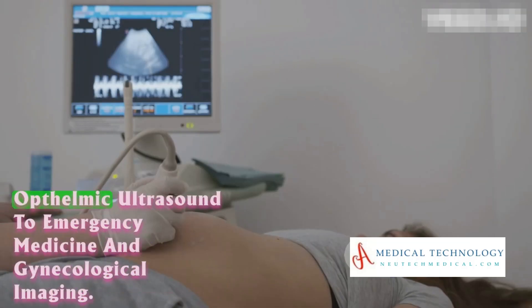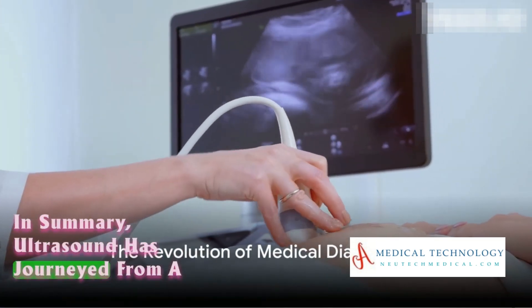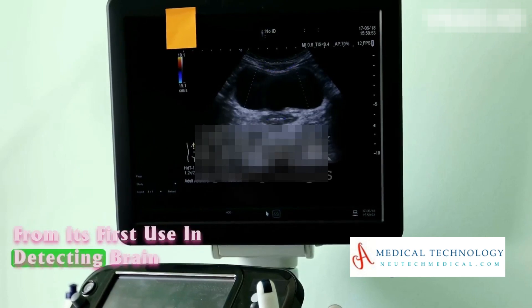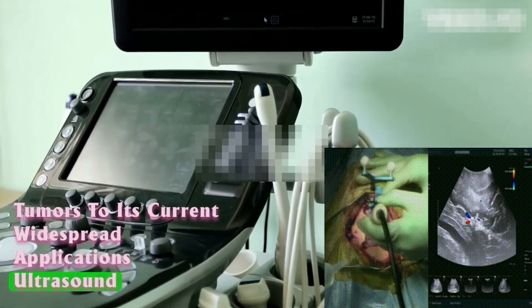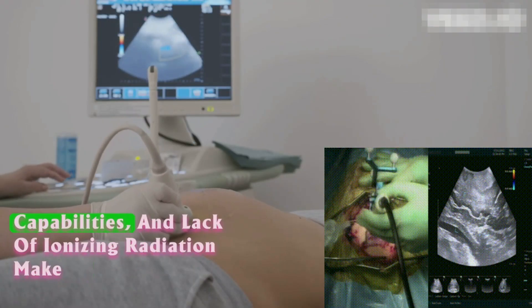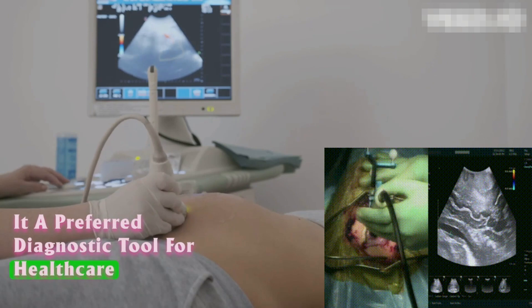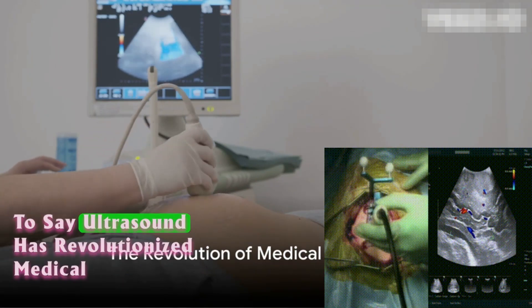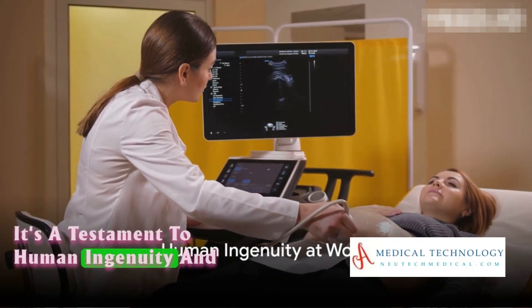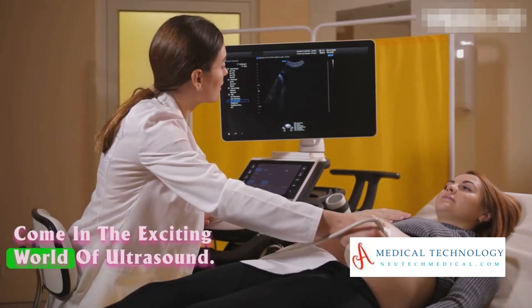Today, ultrasound has permeated every medical specialty — from neonatal imaging, urological imaging, and ophthalmic ultrasound to emergency medicine and gynecological imaging. In summary, ultrasound has journeyed from a novel concept to an indispensable diagnostic tool. Its non-invasive nature, real-time imaging capabilities, and lack of ionizing radiation make it a preferred tool across specialties. To say ultrasound has revolutionized medical diagnostics would be an understatement — it's a testament to human ingenuity and the relentless pursuit of better healthcare.